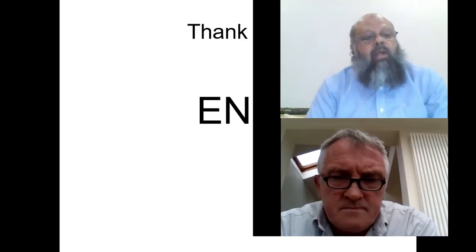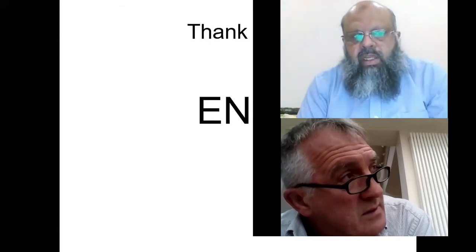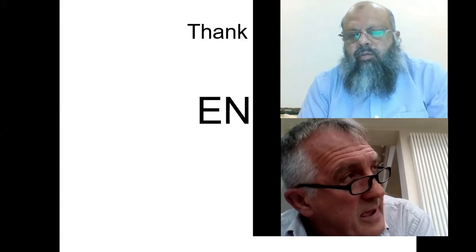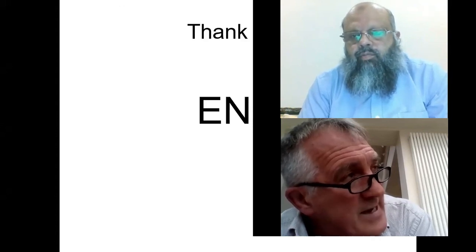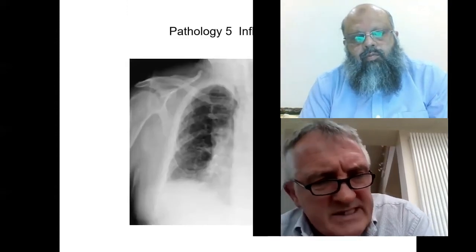Thank you. Another question from Ms. Maida Tahir. Does the cystic linear shadow on X-ray have any differential other than fibrosis? It does what, sorry? Does the cystic linear shadowing on X-ray have any differential other than fibrosis? Cystic linear shadowing. Yeah. Well, let's just go. I don't quite know what cystic means.